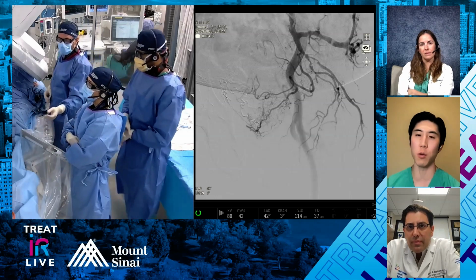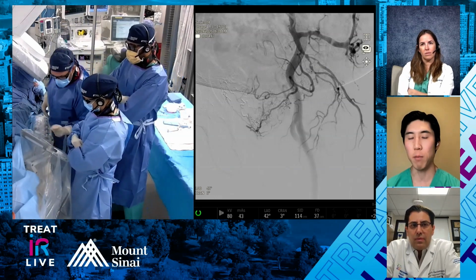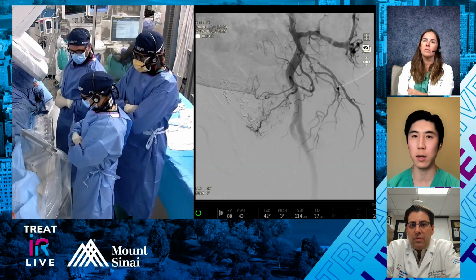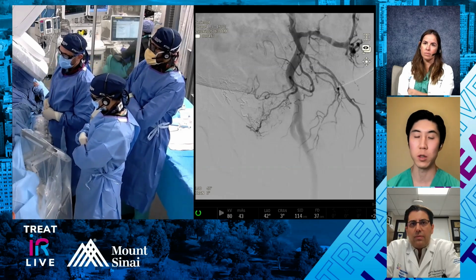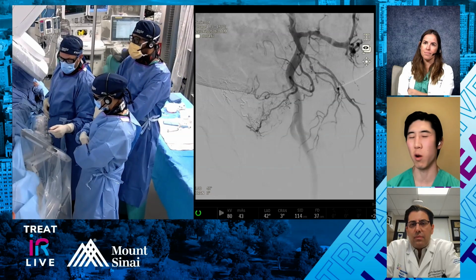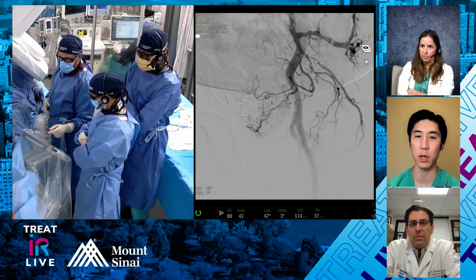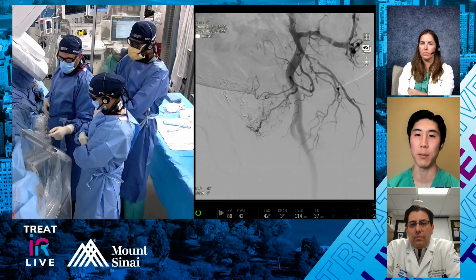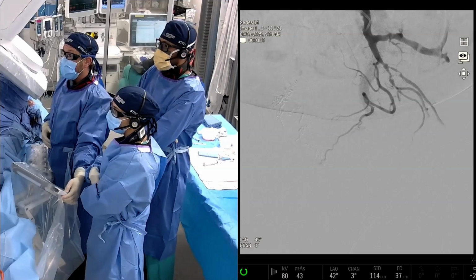I think as you develop more experience, you understand the patterns of the anatomy. I think that it probably isn't required for every case, but it certainly is helpful to have in those situations when you're having a little bit of trouble identifying what the anatomies are, or when the glands in particular are smaller. That's where things can get a little more challenging and difficult to understand what's happening. I'm going to show you guys a couple of things here before we put the microcatheter back in.